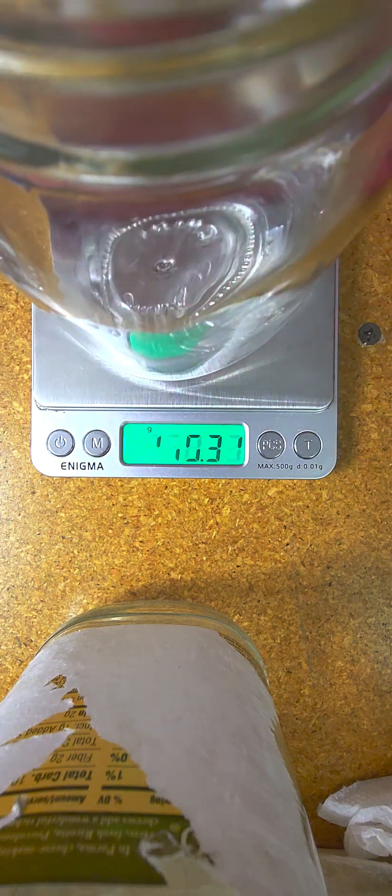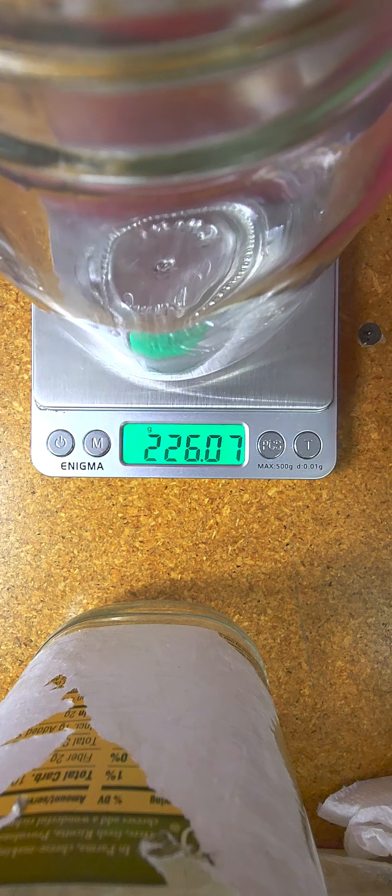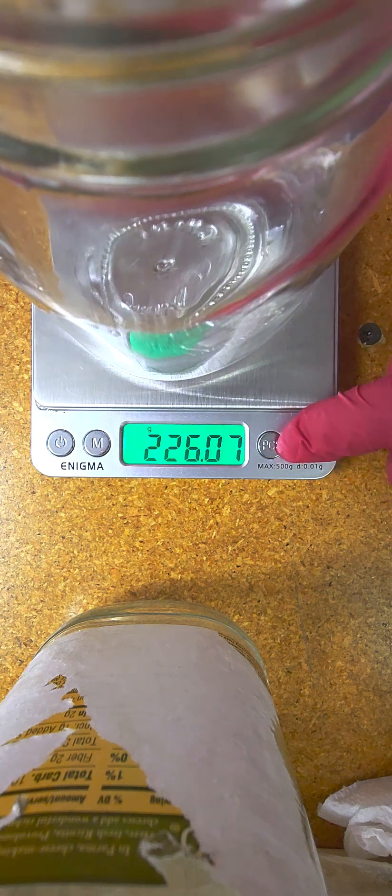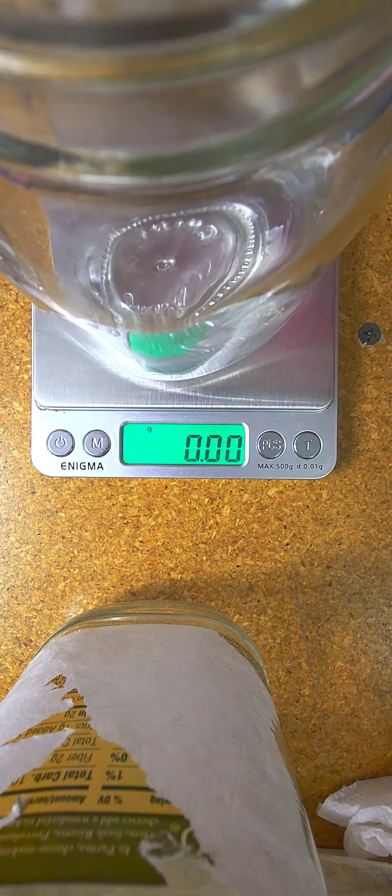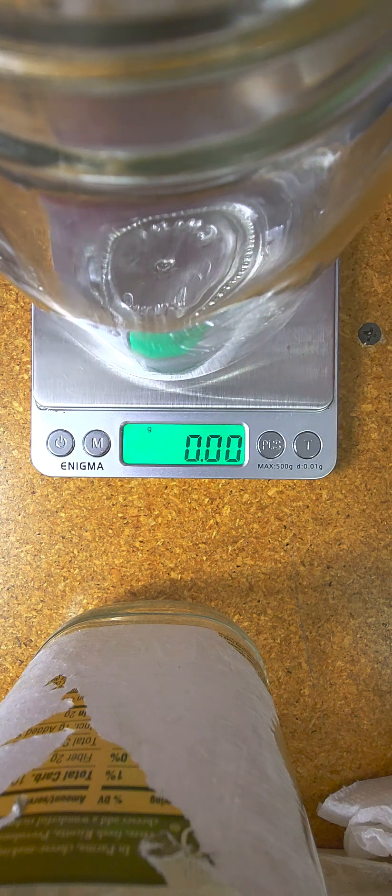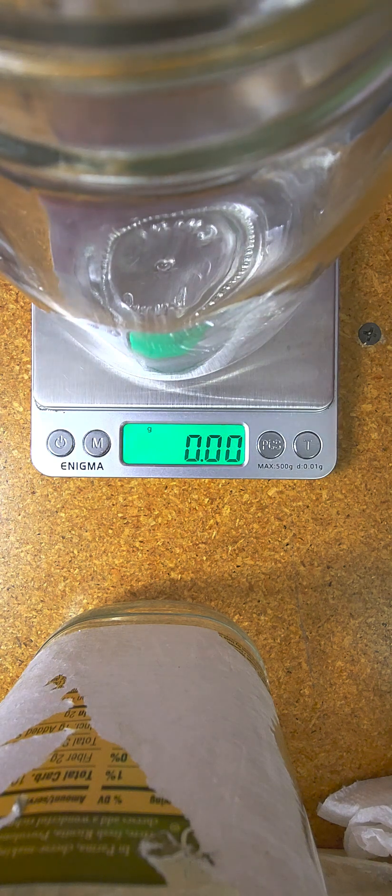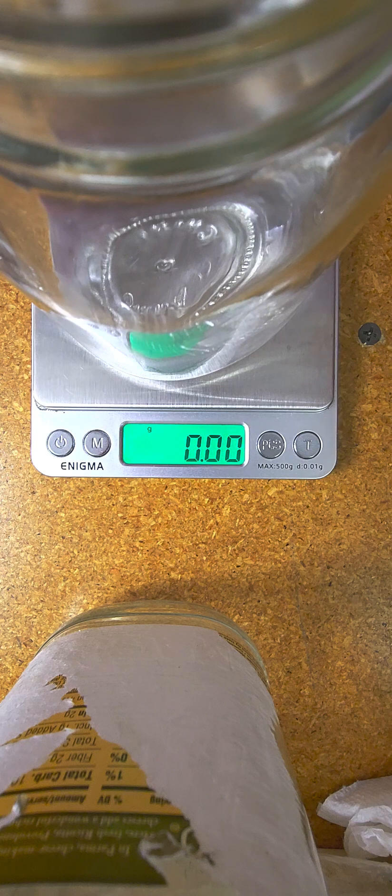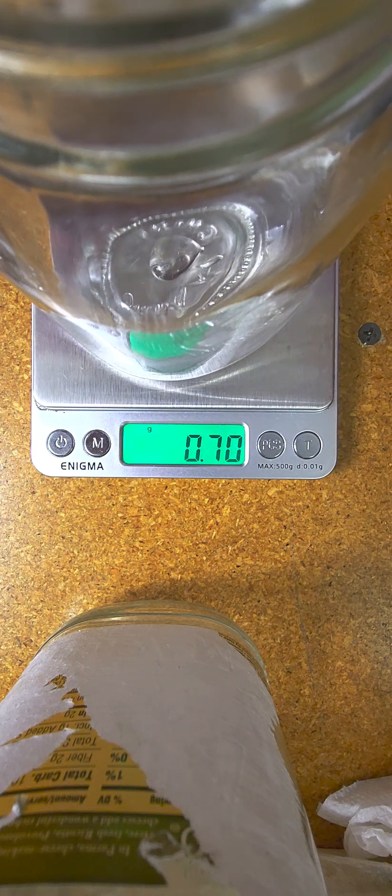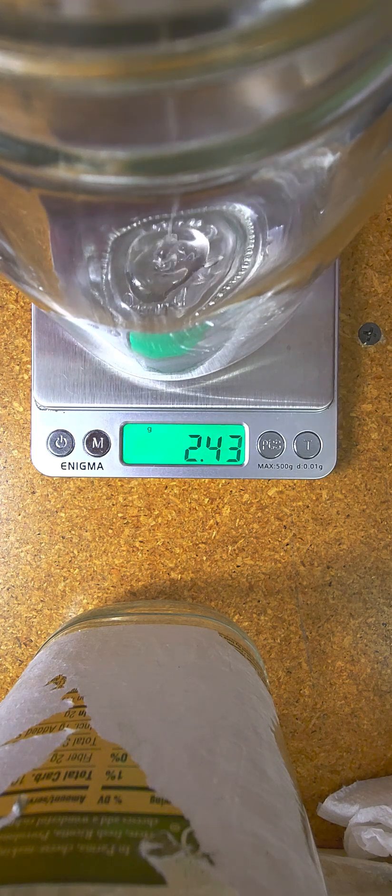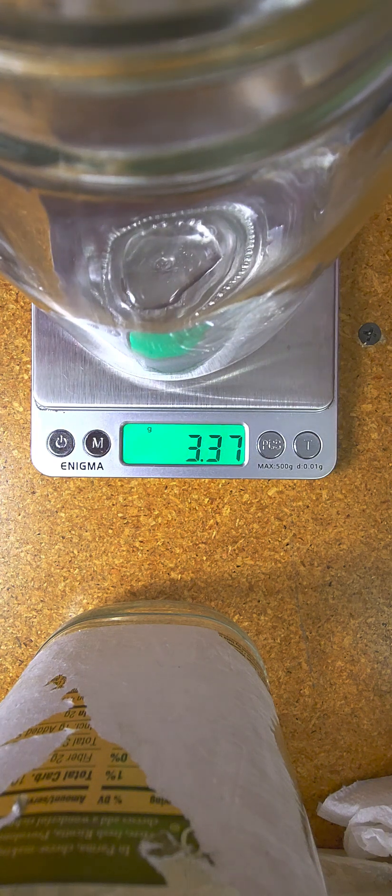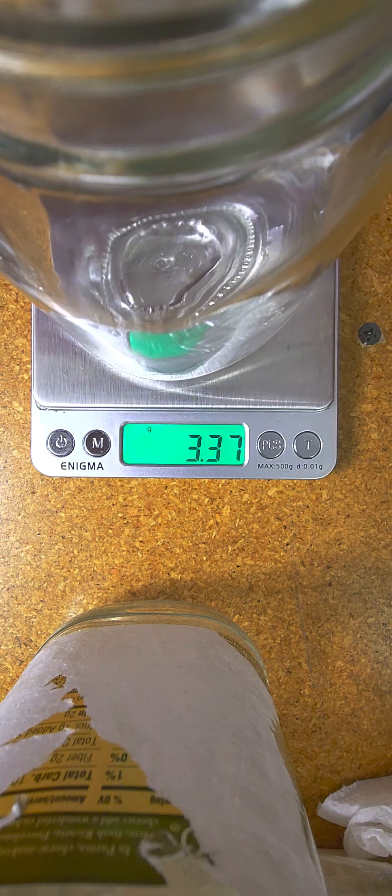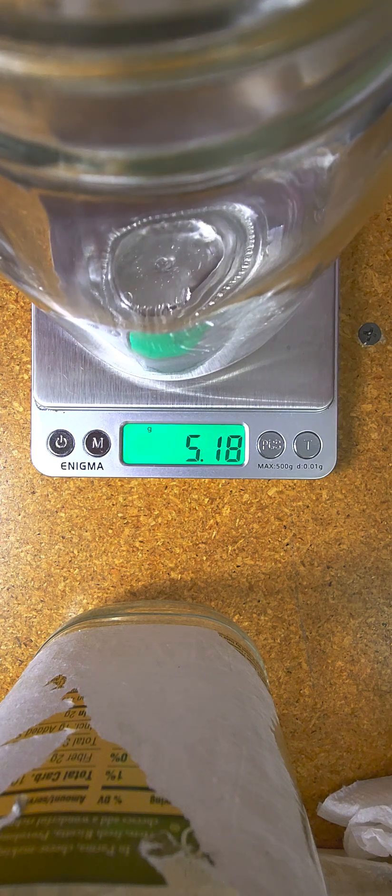We're going to put our jar on the scale and we're going to tare that. We are going to start out with Karo and we are doing a pint jar. If you're going to do a quart jar just double the measurements and the water. We are going to put six grams in our pint jars. Six grams of Karo, that seems to be the sweet spot.